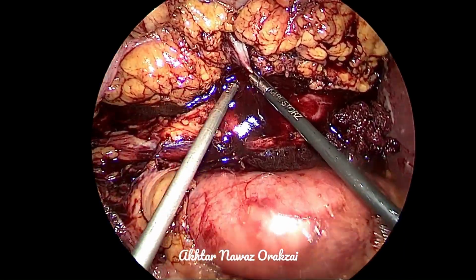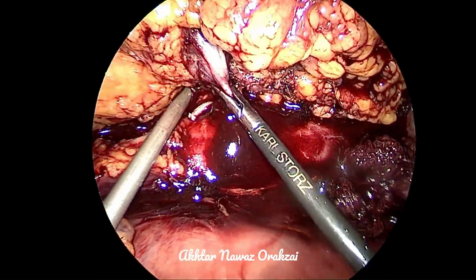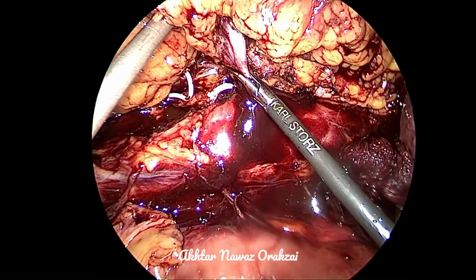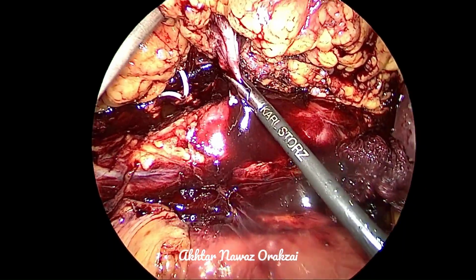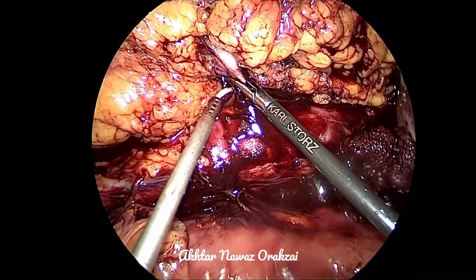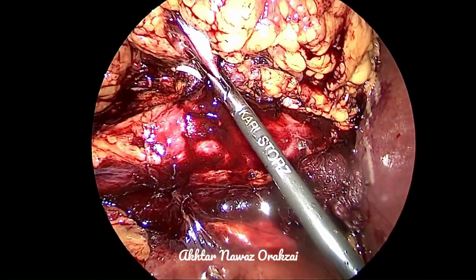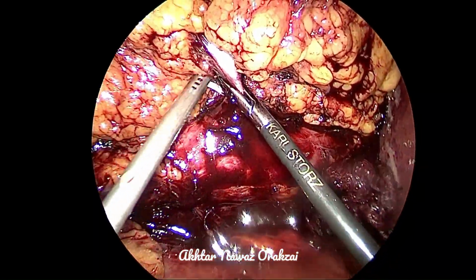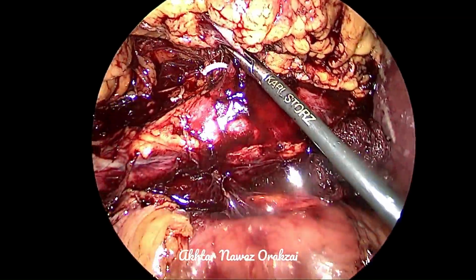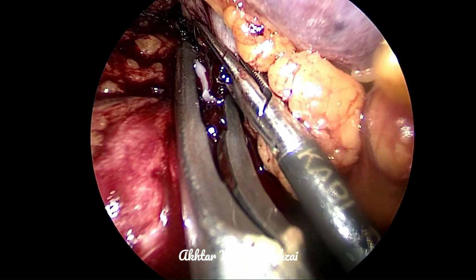at the same time while dissecting. I think in this case, the angle of the clip applicator was not appropriate. That's why it caused this dislodgement of the clip from the applicator, and this led to all these events. So I placed another 10 millimeter port so that the clip can be applied directly over the vein while we are keeping the vein in the grasper.